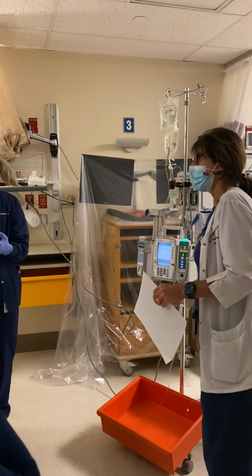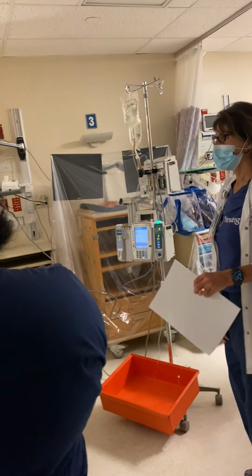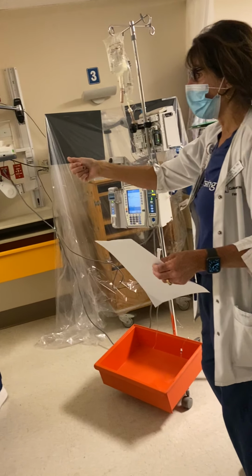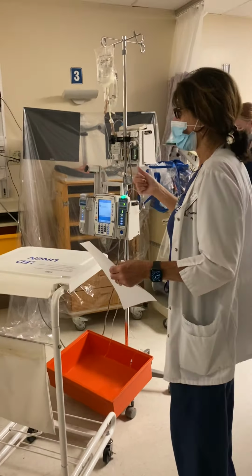Do you want to bring the soil? Do you want to bring the linen, so linen top? Oh yeah, bring that. That'll work, because I want you to be able to check your 6 rights. Okay, so besides bringing your med, your tubing, and your alcohol, don't forget your MAR. You're gonna need your MAR, okay? Remember that.